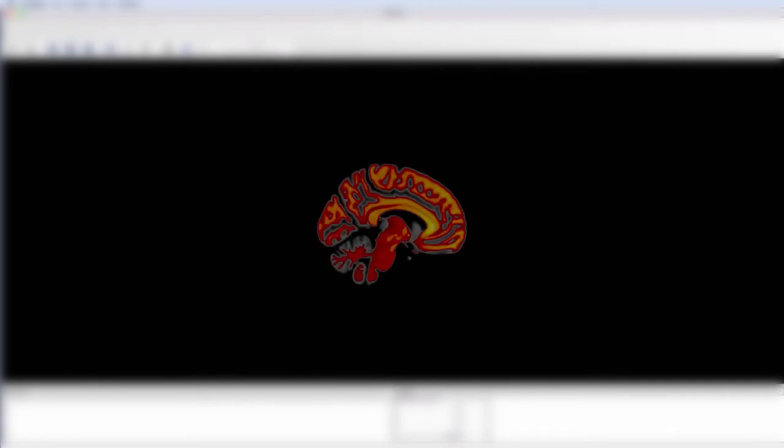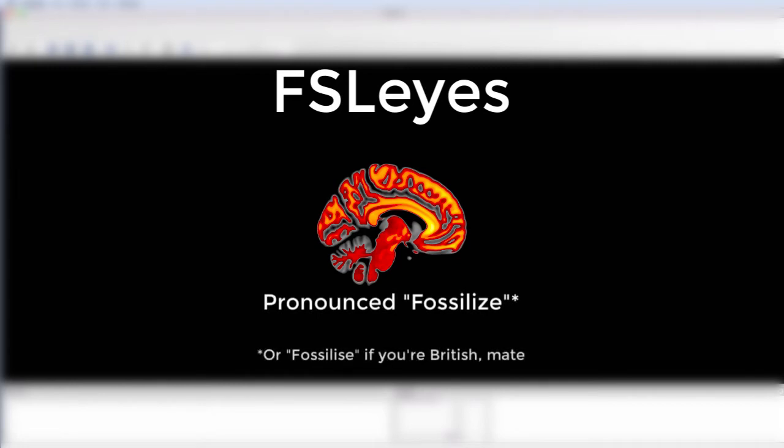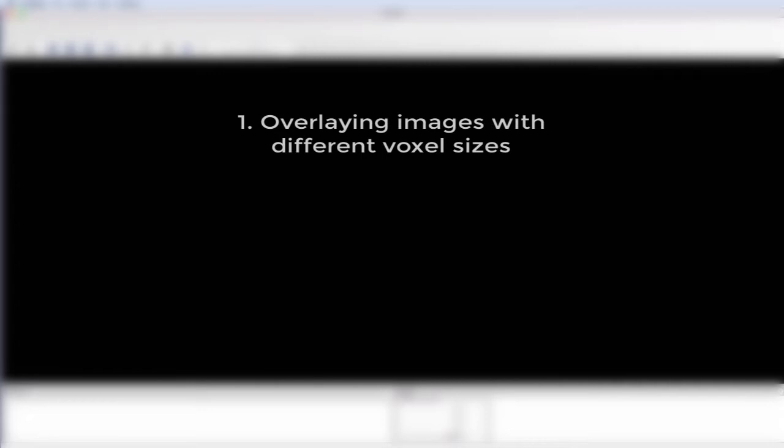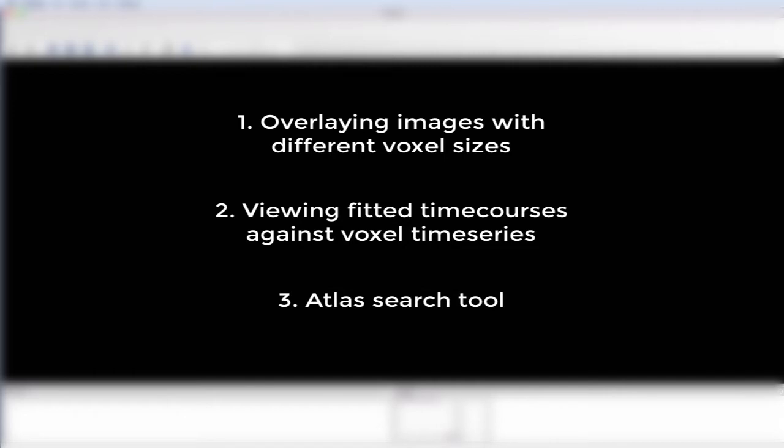A couple months ago, FSL released version 5.0.10, which includes a new fMRI viewer called FSL Eyes or Fossil Eyes. This viewer supersedes FSL View, and it includes several new features to make looking at your fMRI images easier and to help you get closer to your data. So if you're ready, let's get started.